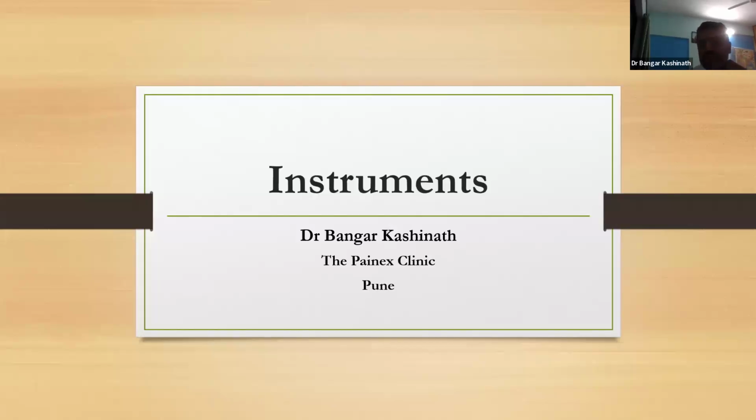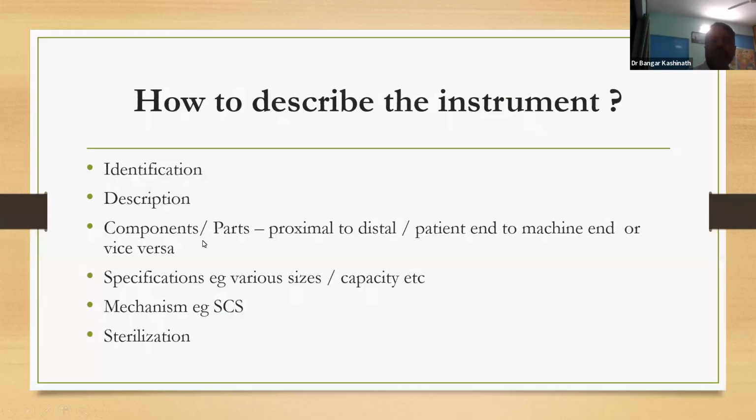So, as far as an exam is concerned, we should describe the instrument properly, right? Any instrument, if it is given to you, first you should identify the instrument. Once the instrument is given to you, you identify that instrument, right?